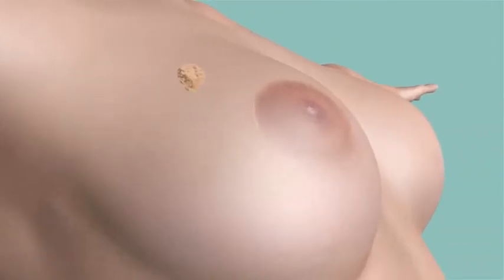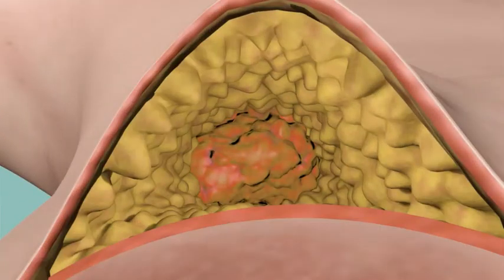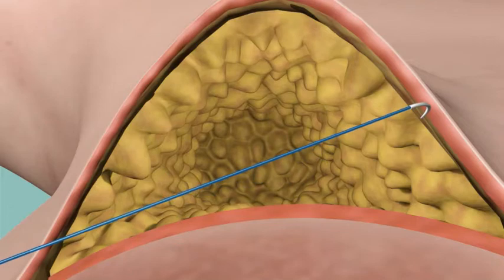Once the tumor is excised, the tumor bed can easily be marked with a VeraForm. As the marker will come with some packaging memory, simply straighten it between your thumb and forefinger and place a simple knot at the end of the marker and trim as appropriate.